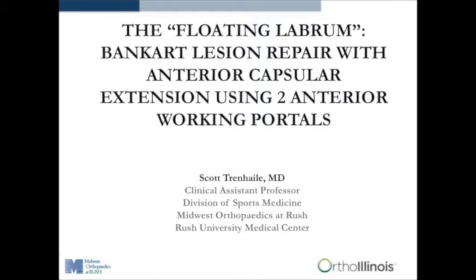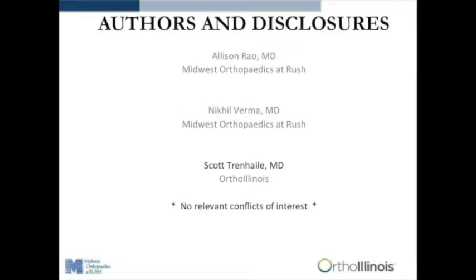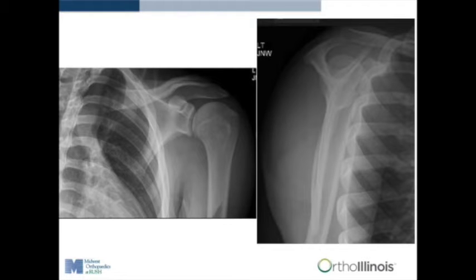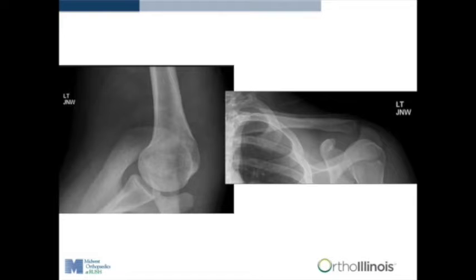The floating labrum, Bankart lesion repair with anterior capsular extension using 2 anterior working portals. The patient is a 16-year-old gentleman who sustained a first-time dislocation of his left shoulder approximately 2 months prior to presentation while playing football. This dislocation spontaneously reduced at that time.